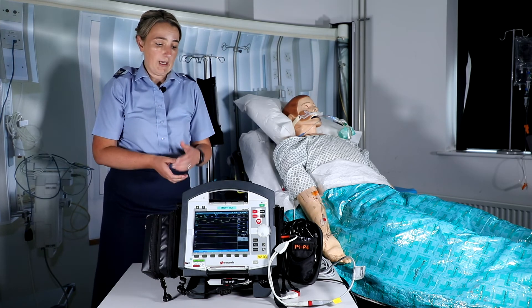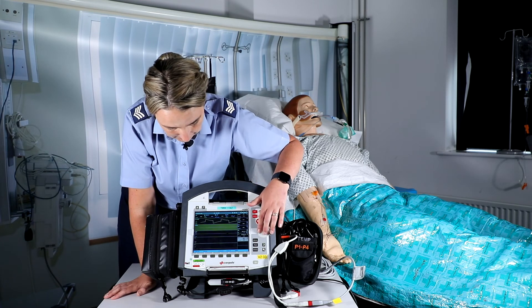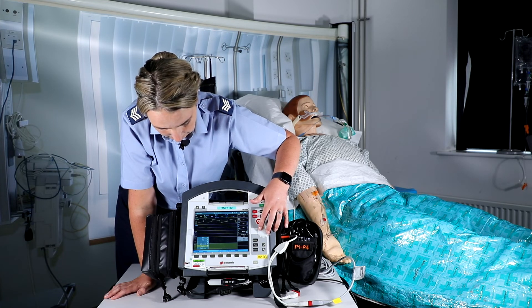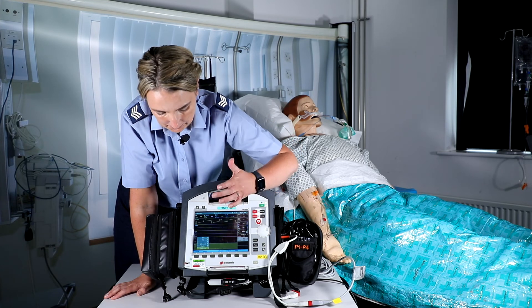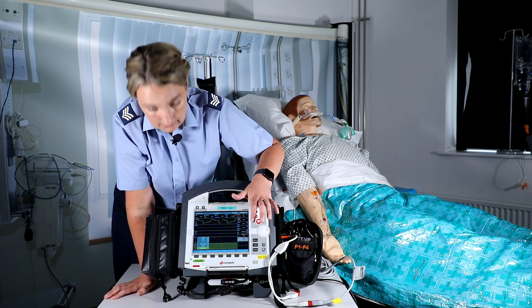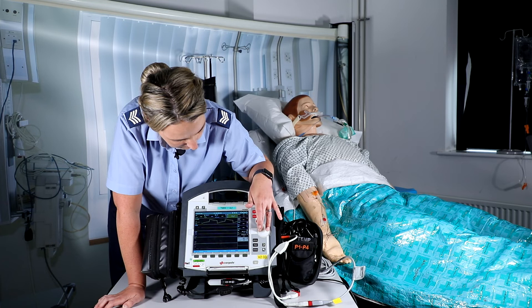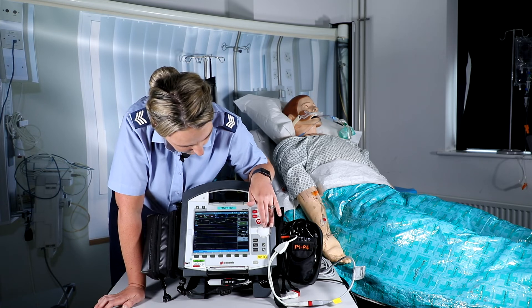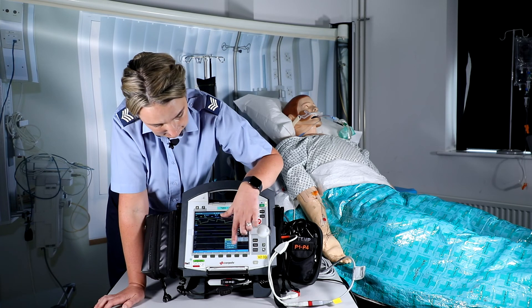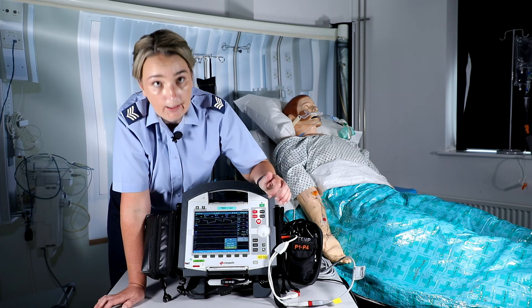The other two methods of calibrating your transducer line are through the curve screen and through the parameters screen. For the curve screen method, go down and select the lead — go into P2, and as you can see down there it says to calibrate. Follow the same process and hit the calibrate button. For the parameters method, scroll down to get onto the parameters screen, go into the P2 parameters, select with the jog dial button, and you can see you can scroll down to calibrate the line. Open to air and calibrate.